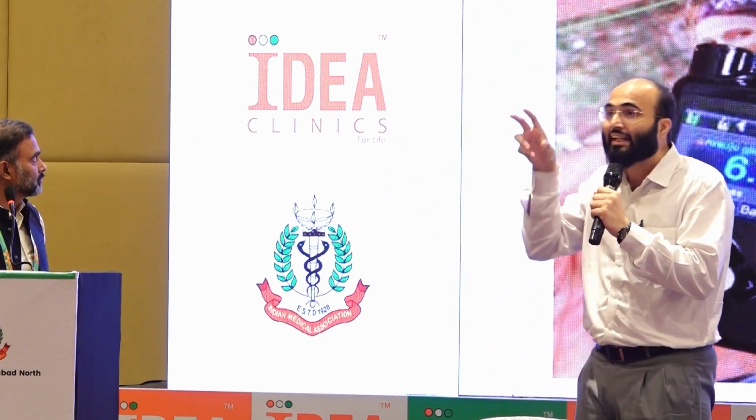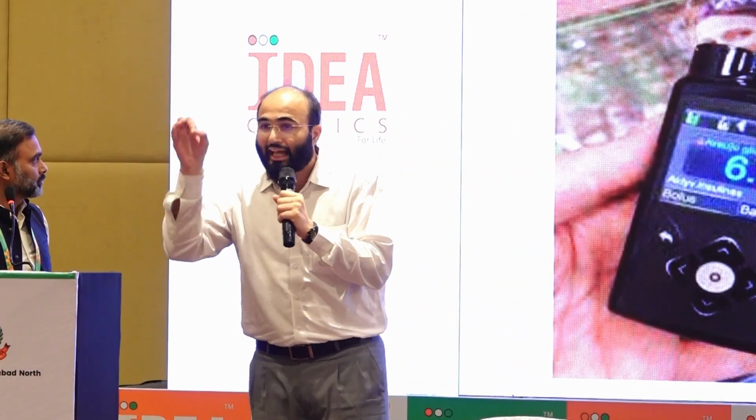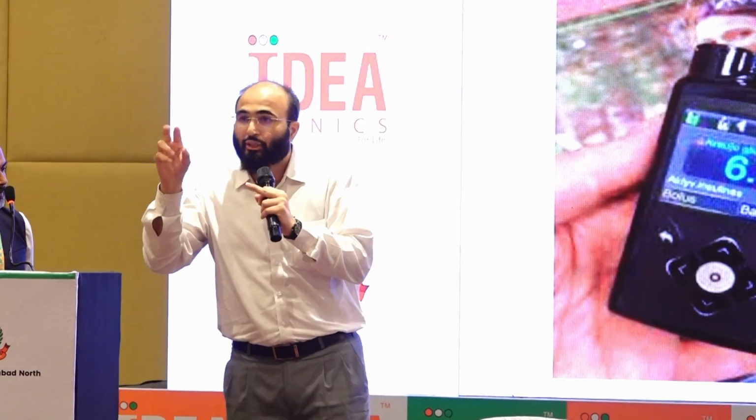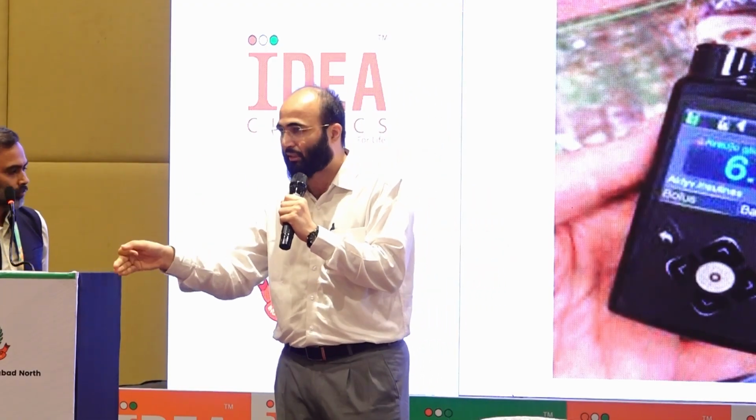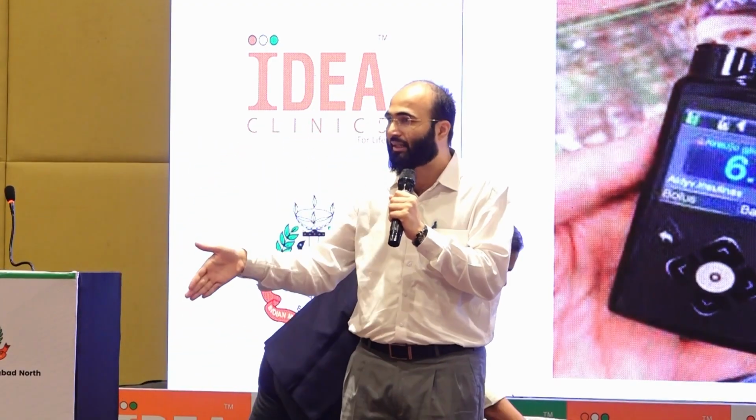To exactly address this problem, we need an insulin pump, something that is going to take care of insulin delivery like the physiology does. Second, check sugars automatically without the child having to prick. The greatest thing that has happened in the domain of diabetes was CGM, which sir was talking about. Only because of CGM, insulin delivery has been made possible. Automation in insulin delivery is made possible.